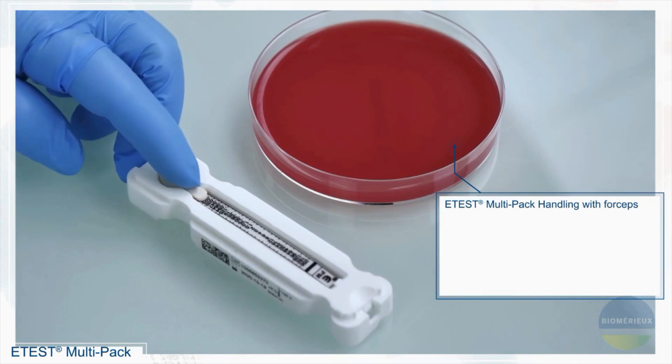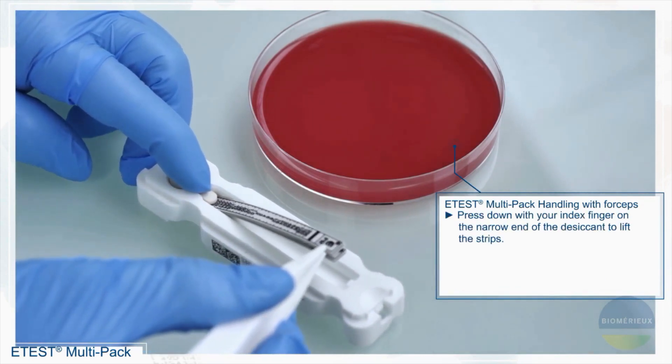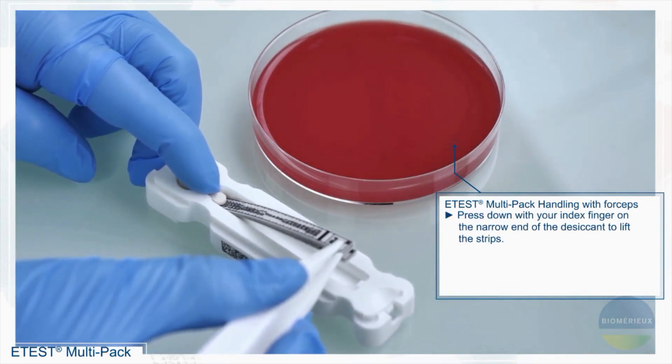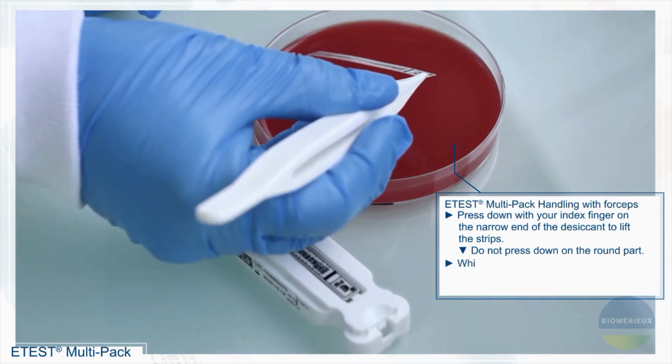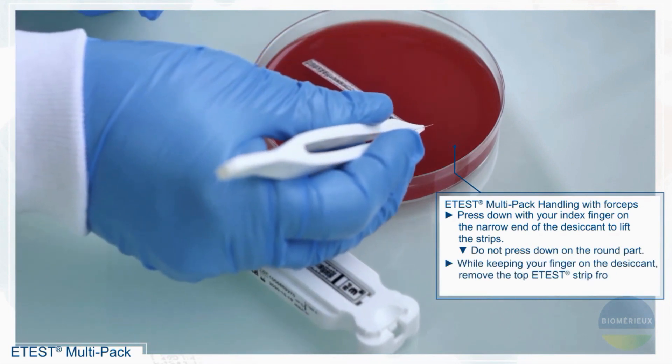eTest handling using forceps. Press down with your index finger on the narrow end of the desiccant to lift the strip. Do not press down on the round part. While keeping your finger down on the desiccant, remove the top eTest strip from the packaging using the forceps.